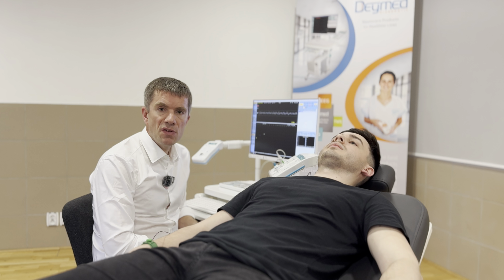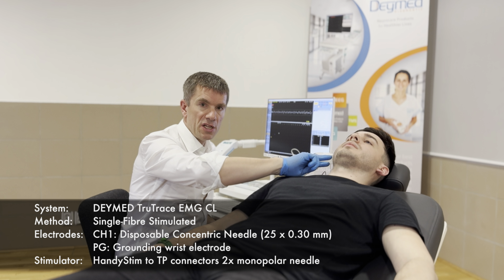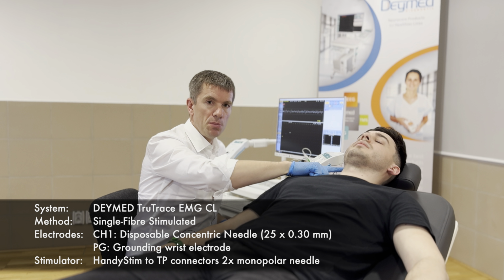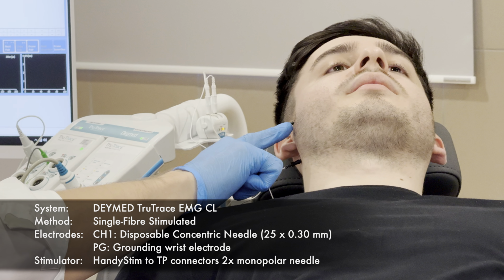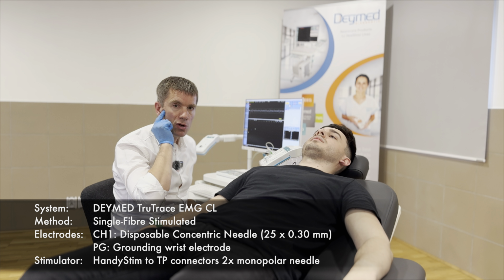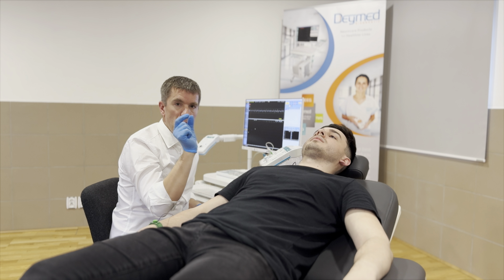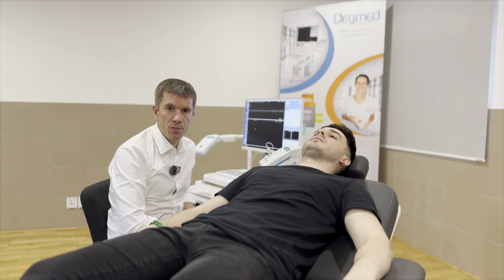For this stimulated single-fiber EMG, we use two monopolar needles. One is the reference, put behind the ear. The other one is the stimulating monopolar needle, and this we put in a small hole that you can feel in your os zygomaticum in front of the ear. Over there we put the needle, a very short needle of 1.5 centimeters.